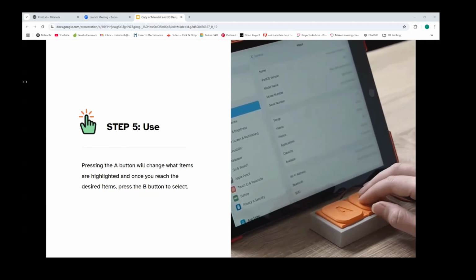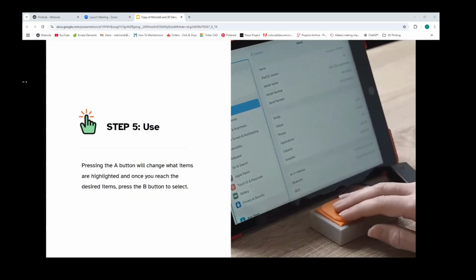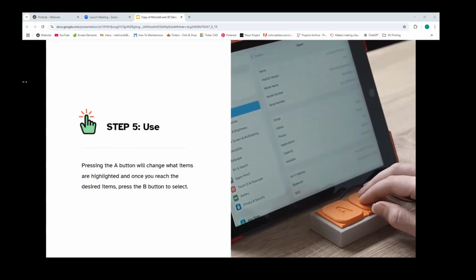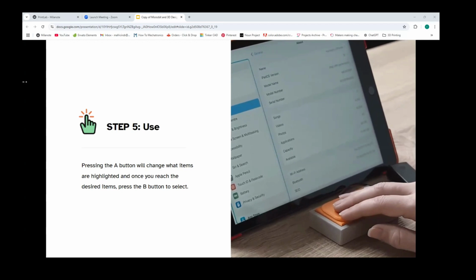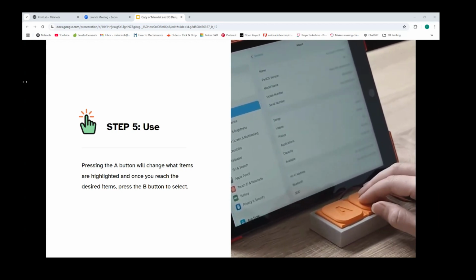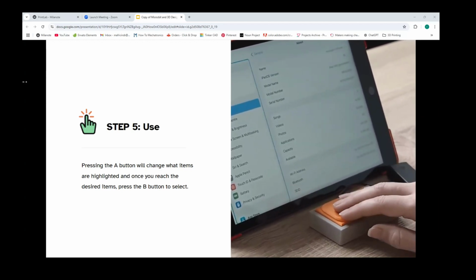So again, this is kind of going over how this works with the assistive control. And in this example, we're using an iPad, but this can be used on all kinds of devices. It still kind of blows my mind that you can activate pretty much all the functions on a really complicated device like an iPad with literally just 2 button clicks. And the ability to do that now is absolutely amazing, with something as cheap as the microbit.